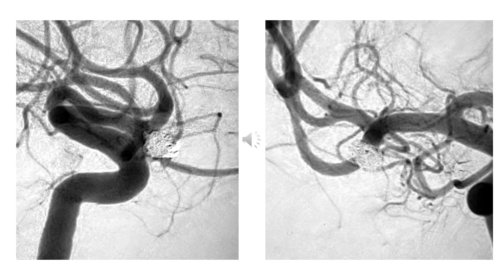This is the final configuration with which the patient lives. We have all the arteries filling, the neck is well reconstructed. The shelf formed by the LVIS EVO was working very well. We can see that the coils are maintaining their shape, their outline.